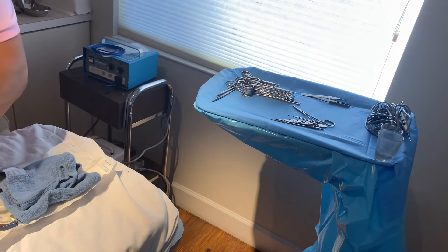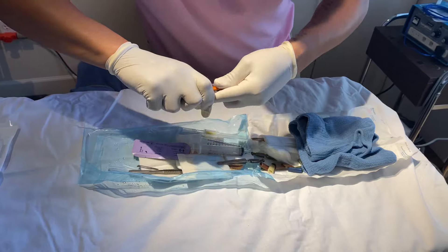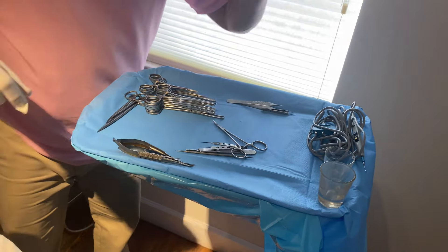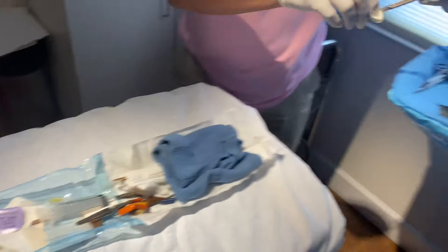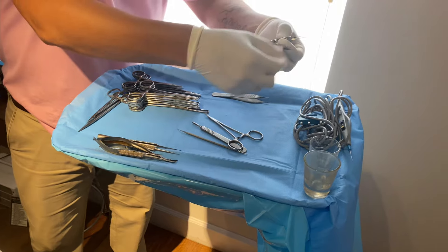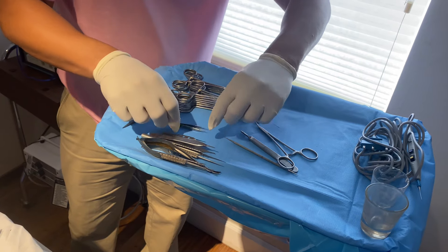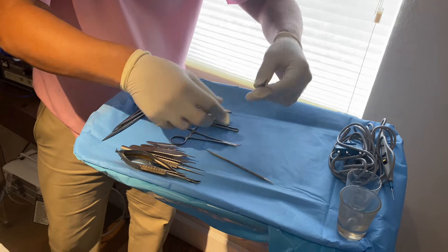Then we have these instruments — I think they're needle drivers. I'll take off the tips and stack them from biggest to smallest. Then you have this one right here — just take off the tip. I put them all together right there so Dr. Stein can look at them and find them exactly where he expects them. You always have a pointed hemostat as well.